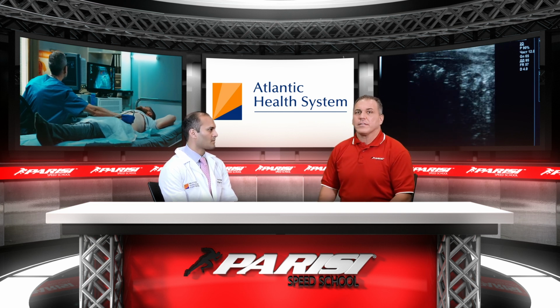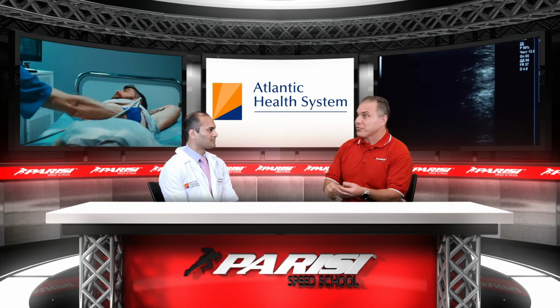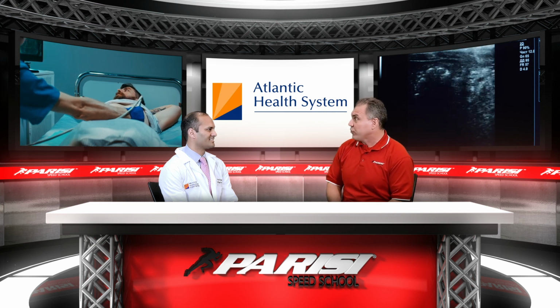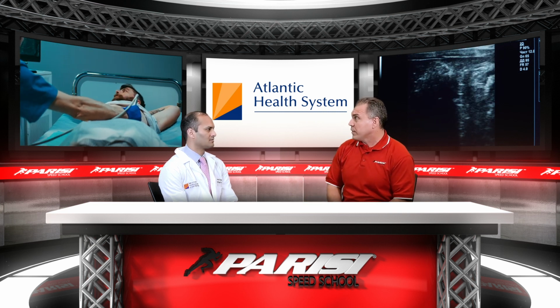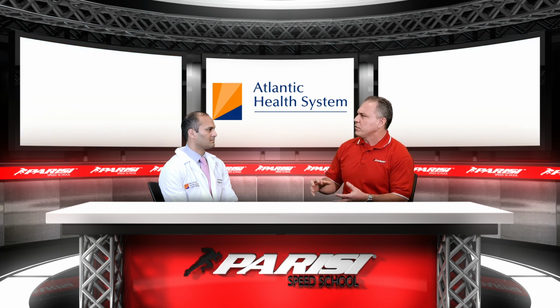And I feel the technology in ultrasound has really accelerated from what I see. I see doctors using their cell phone with ultrasound, and now ultrasound can actually look at the fascia, the connective tissue within the structure. So it's really amazing the advancement that you're able to do that in real time. That's right, Bill. There's a lot of real-time information, and image resolution has gone up a lot. It's not just this fuzzy black and white picture like one of those old TVs that we used to have. We're getting a lot of high-definition images on ultrasound.